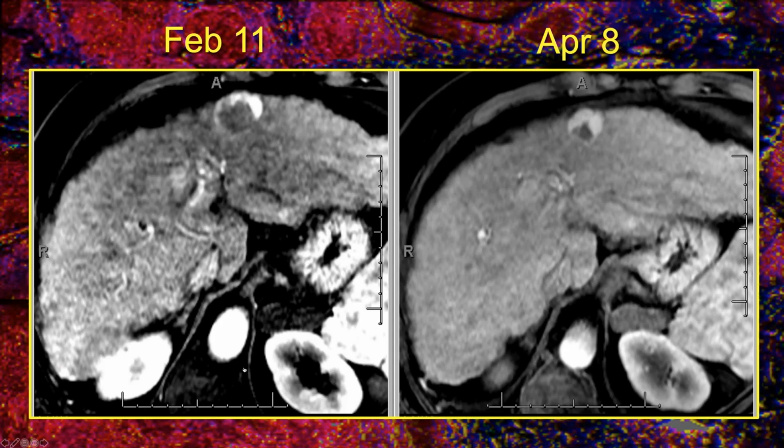And how does that viable tumor look between the two exams? Now the shape is a little different because the necrotic portion is retracted, but there's no way you would say that the viable tumor has gotten smaller. In fact, it may even be bigger. To actually measure the one dimension that's by definition how you report it, it's probably similar, but I think on April 8th, it looks a little bit thicker. So in all likelihood, the viable tumor is growing. So this really should get treated.